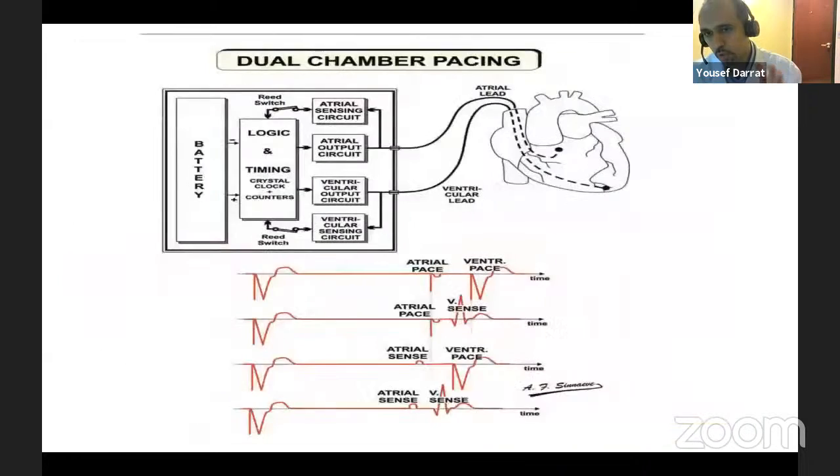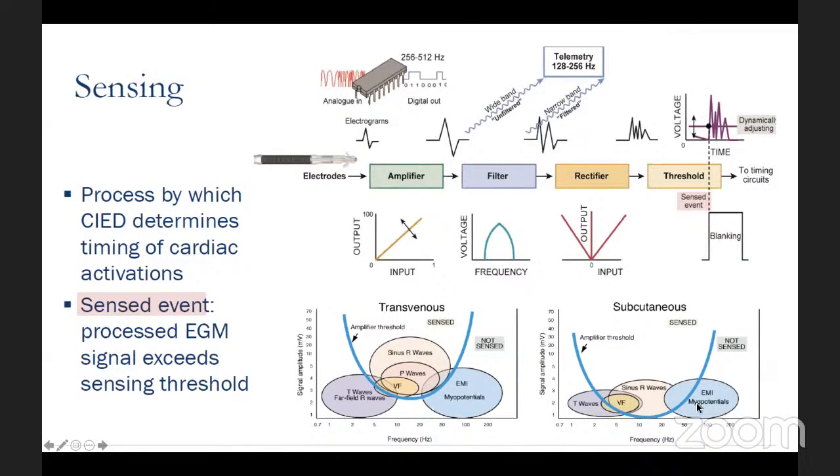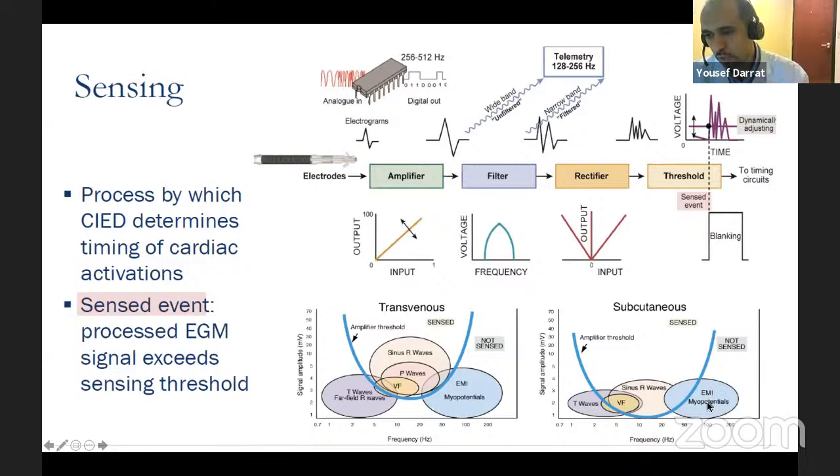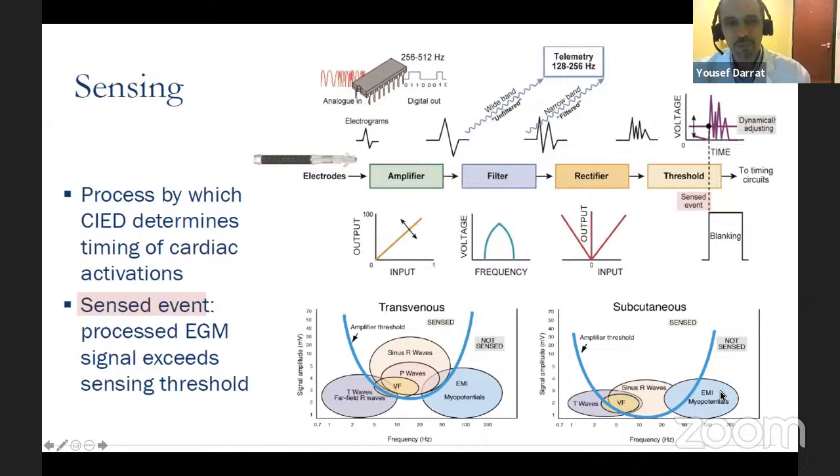Even going through a store like Macy's, or the magnetic detection gates and airport security, all of that should be safe. They pass through for a second and nothing should happen. The only situation, don't go inside the microwave, right? That's why I tell them not to stick their chest in the microwave.